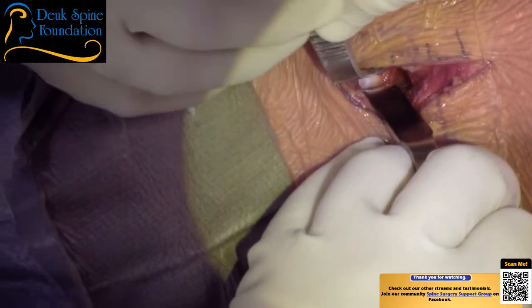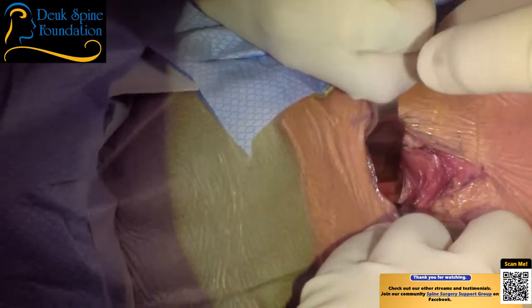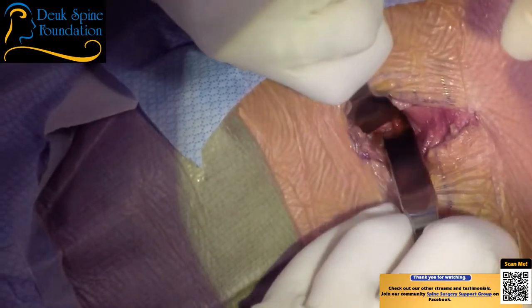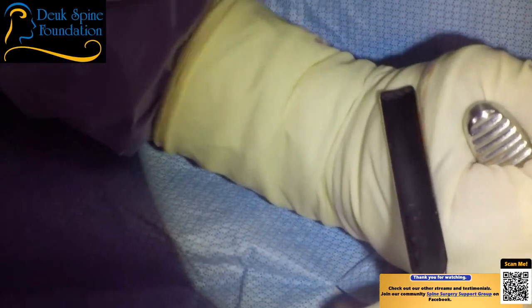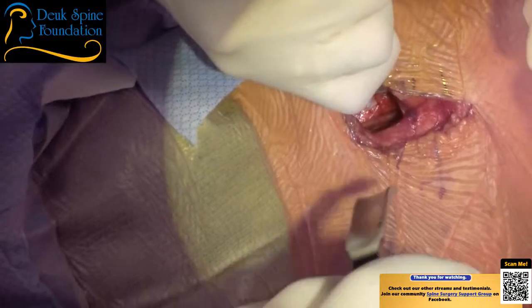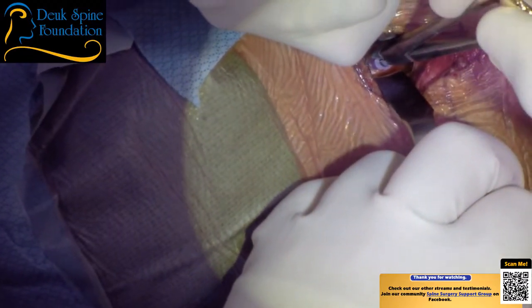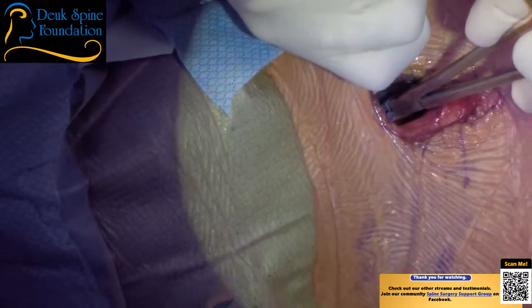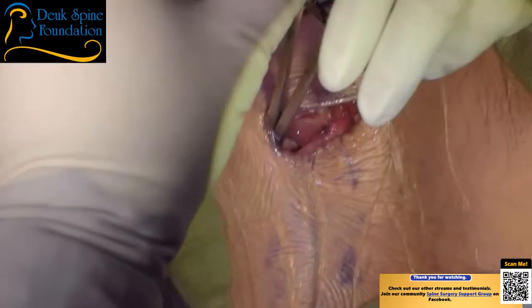Hold this here. Localizer. Let's get a fluoro shot. Okay, Dr. Patel, look, when you retract, let me show you. When you retract, you've got to retract with the tip, not your hand like this. That's not helping. You have to pull the whole thing over. There you go. All right, perfect. Let me have the localizer quickly. This is going to be super long blades. We have 55, 60. All right, come out. Don't knock me. All right, so we're looking at one disc. We've got it pinned. Hold this, please. And then we're going to see which disc it is. Don't let it come up, okay?